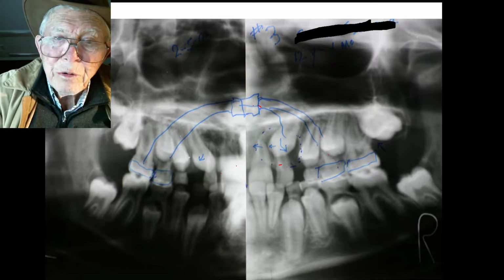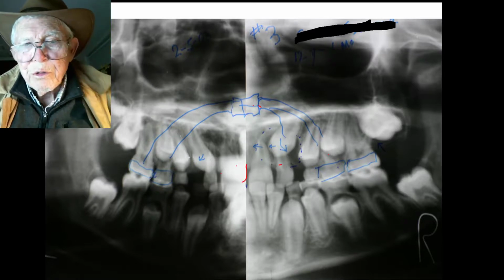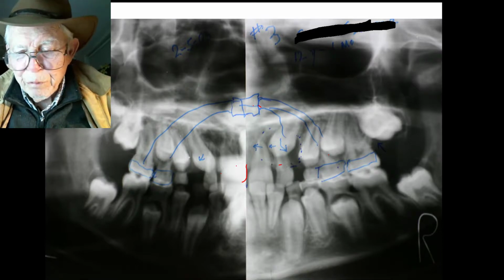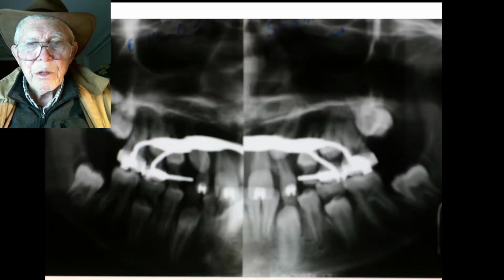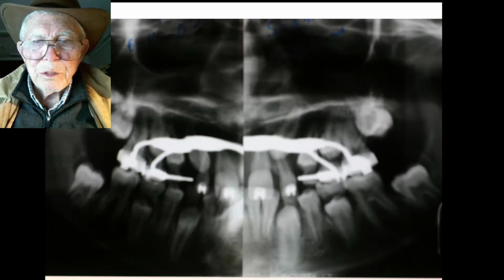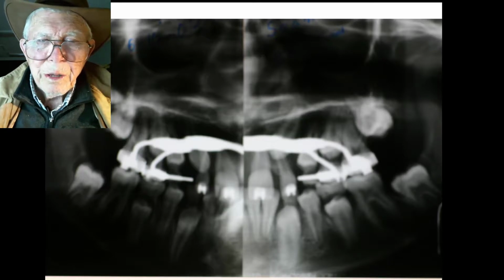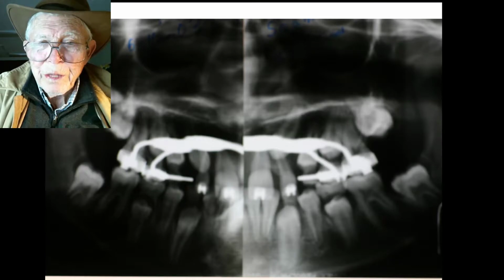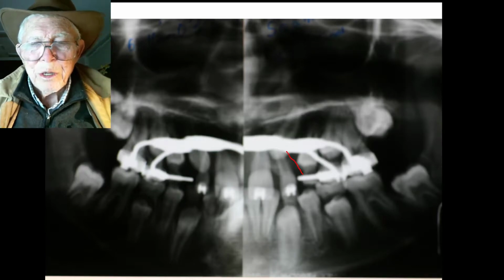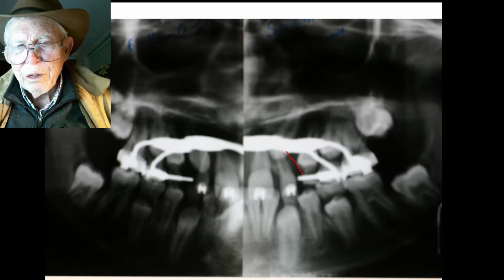So we learned that later on for older people, we want something in the front tooth to give a better pull on it. So let's see what we do here. Okay, here's the palatal separator in. It's opened up some space to get this cuspid off of that lateral and get it to come down into that space.